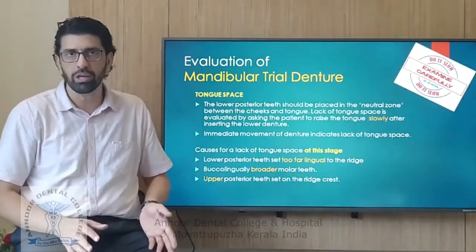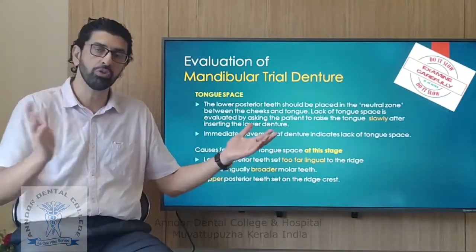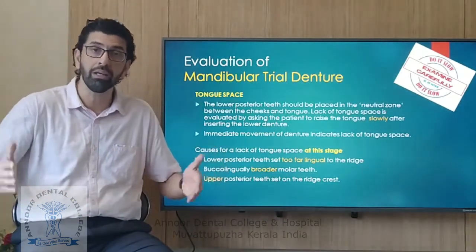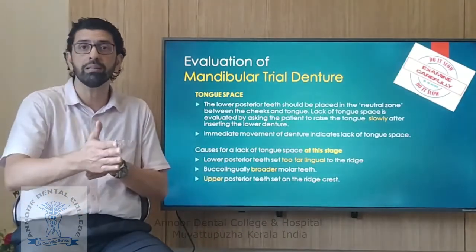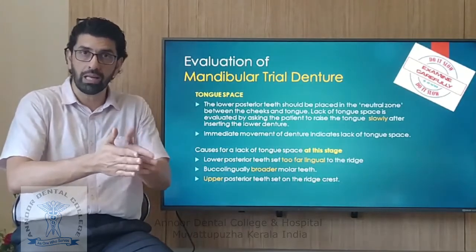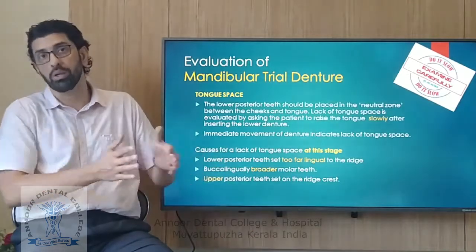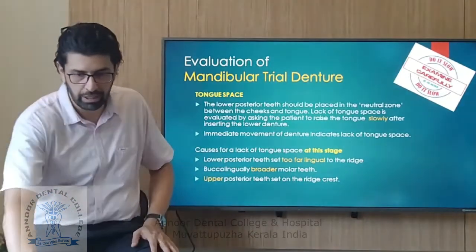If you do it any other way, chances are that you've got it either too far out buccally or too far out lingually or sometimes even diagonally. When I say diagonally, I mean the teeth at some point is in the right position and at some point is either flared out buccally or going in lingually. So take care of this aspect.